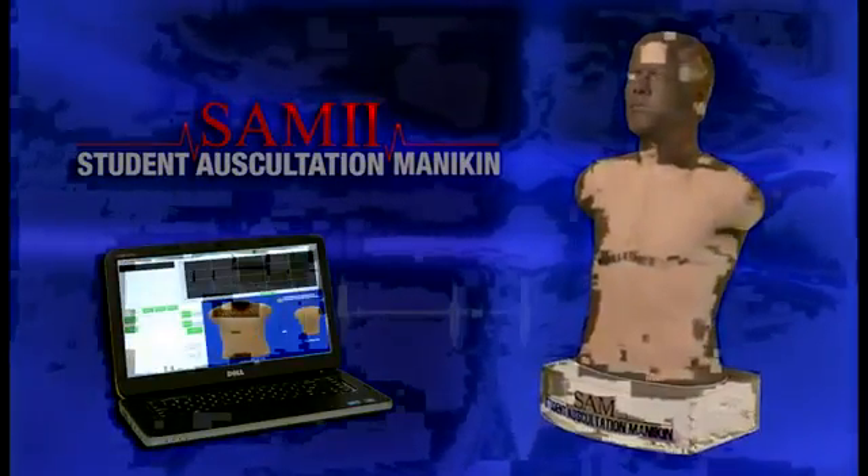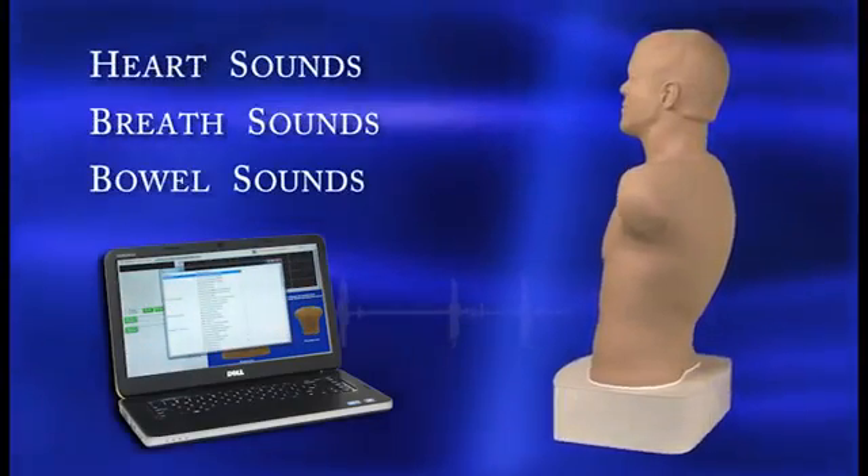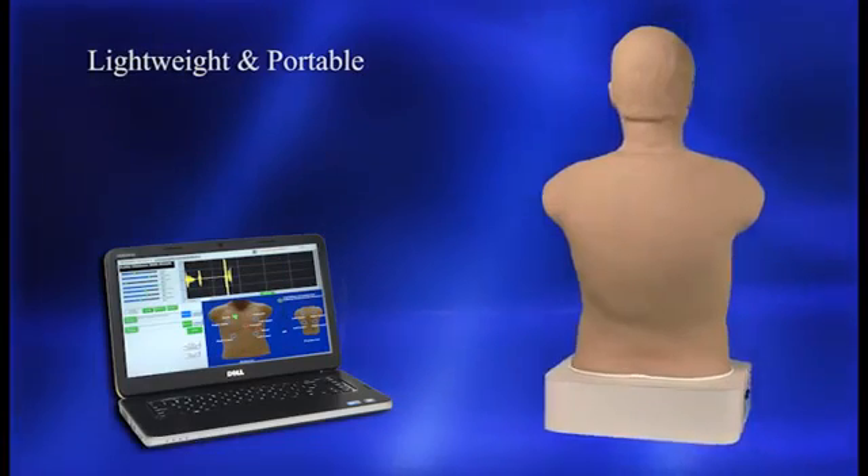SAM-2, the student auscultation mannequin, is the latest innovation in teaching and learning heart, breath, and bowel sounds. Weighing only 23 pounds, SAM-2 is portable and easy to use.